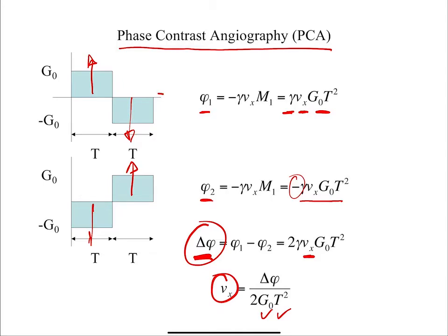Well, this is a function of time. Yeah. If you look at the expression, you're taking the gradient and multiplying by time at every point in time and then integrating that. Okay. So I'm taking that waveform and multiplying it by t, right? And then that's the integral. Okay.